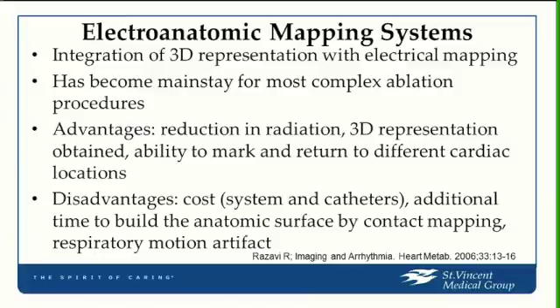When you do that fluoroscopically, remember, that's a two-dimensional representation. So if you want to say, I'm going to put it here, you don't know what the depth is of where you're putting it. The disadvantage is that it's costly, and it takes a little bit of additional time. Usually that little additional time, in my mind, is offset by the reduction in X-ray imaging.